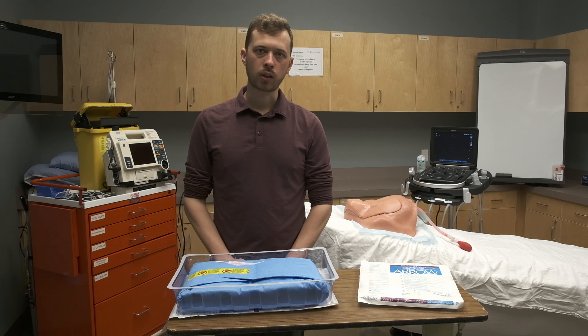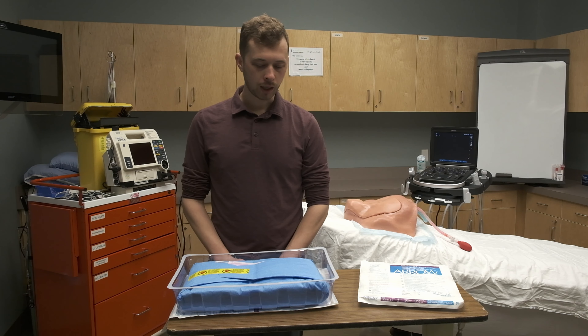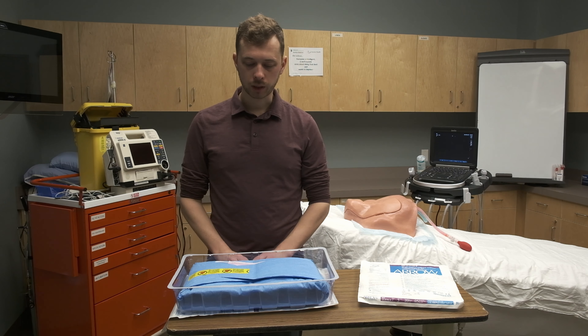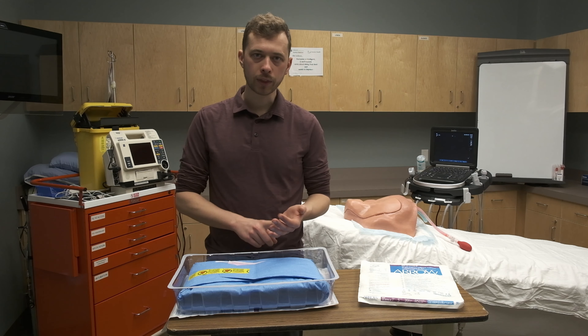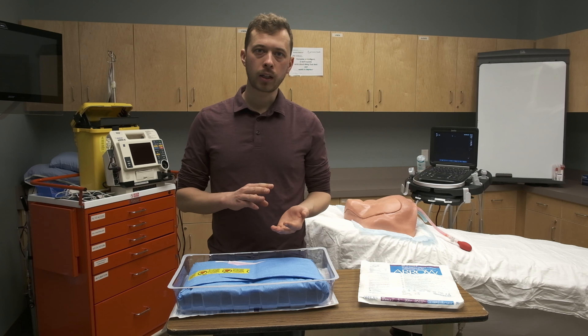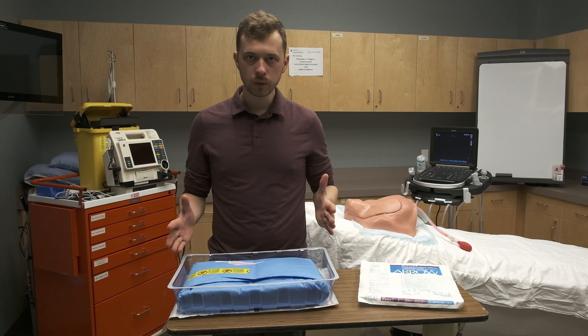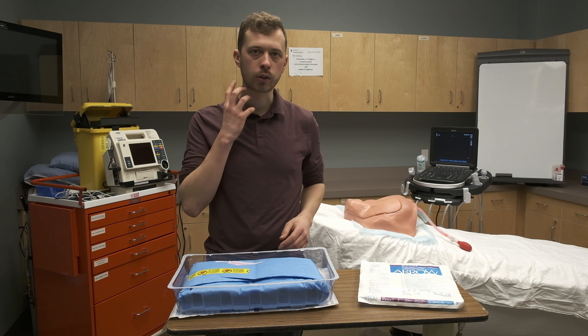Hey everyone, I'm Alex Senger. I'm one of the resident doctors at Kelowna General Hospital training in emergency medicine. Today I'm going to be showing you all sorts of stuff about the Seldinger technique. We're going to talk about what the Seldinger technique is, why it's important, and then I'm going to demonstrate all the tools used on an ultrasound guided jugular central venous access.